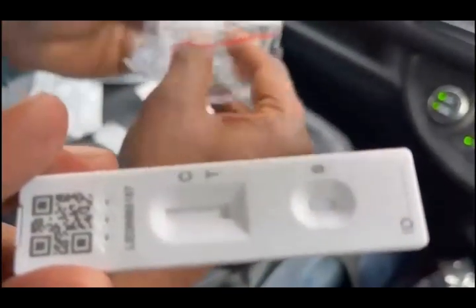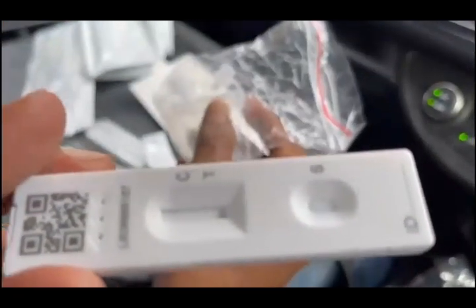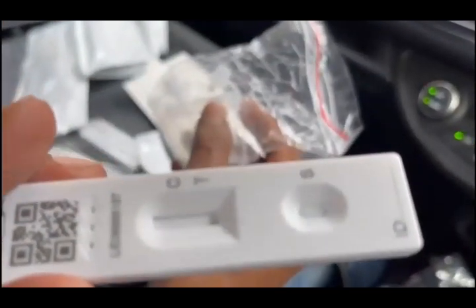Today we're going to put it in the container. Just get the pen on it.